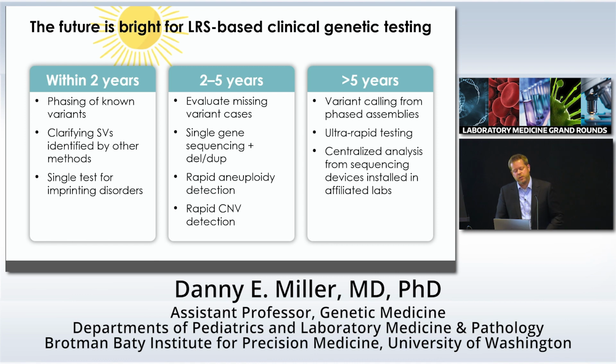You can also think about things like rapid aneuploidy detection for products of conception. We can do that for, if you're in MFM clinic, you do an ultrasound and you see something abnormal, can you get mom's DNA or get blood and do cell-free DNA testing quickly? Is that possible using this technology?